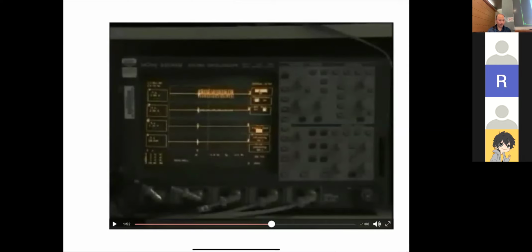Okay, so what you're hearing there is the gradients telling the subject to swallow, but then the next thing you hear is the EPI pulse sequence. That's that going back and forth, zigzagging through K-space, okay?